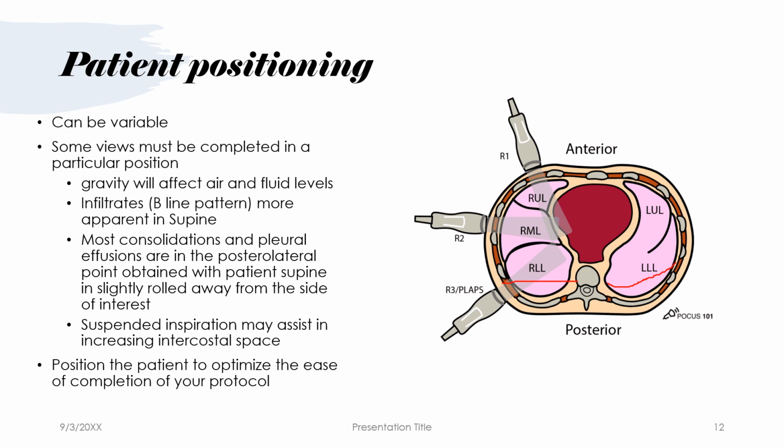Now, because some of these positions, like looking for a pleural effusion from this posterior aspect of the body, would require us to get our hand in between the patient's side and their bed, sometimes we may need to roll our patient up into a slight LPO or RPO in order to access that. It can be challenging, especially if your patient's intubated or something, but just get some help in doing that so that you can get the appropriate window and get a good assessment there.